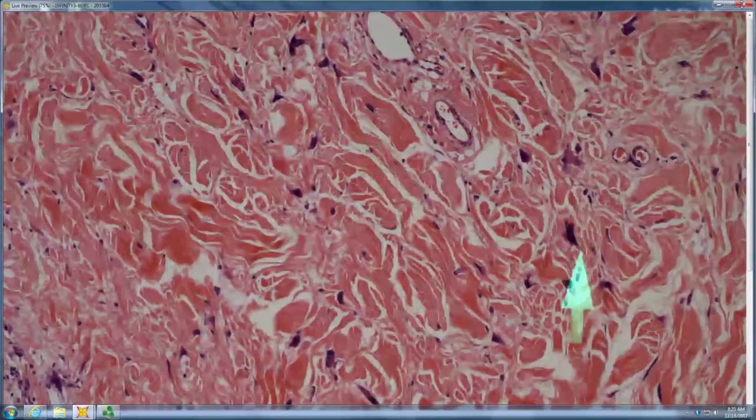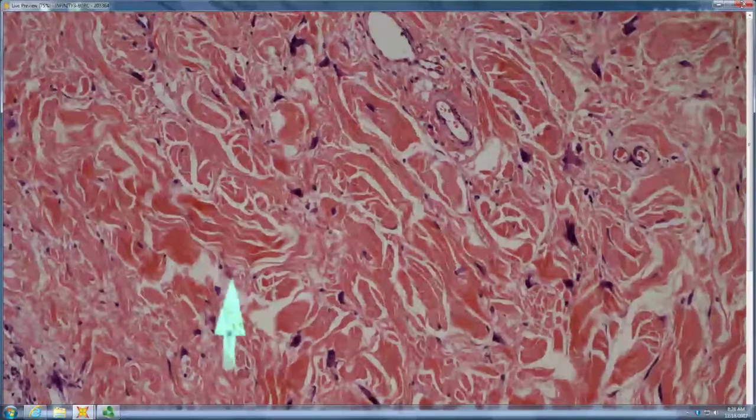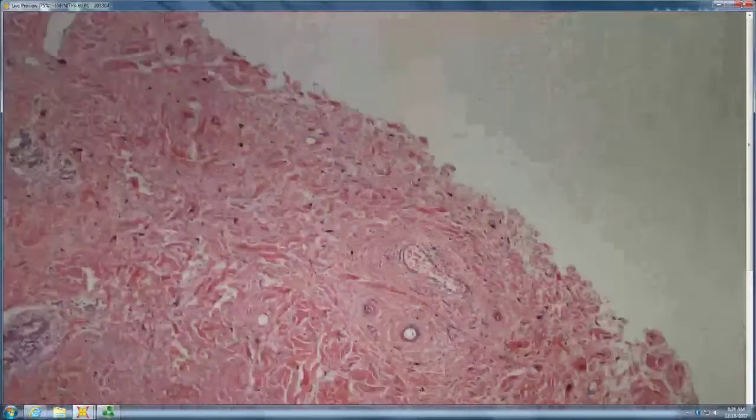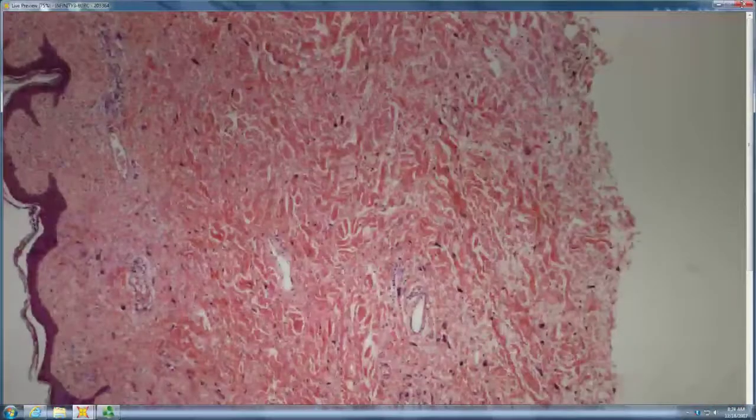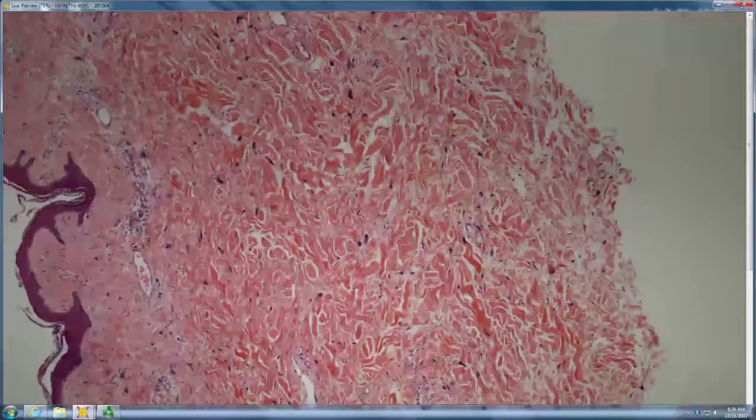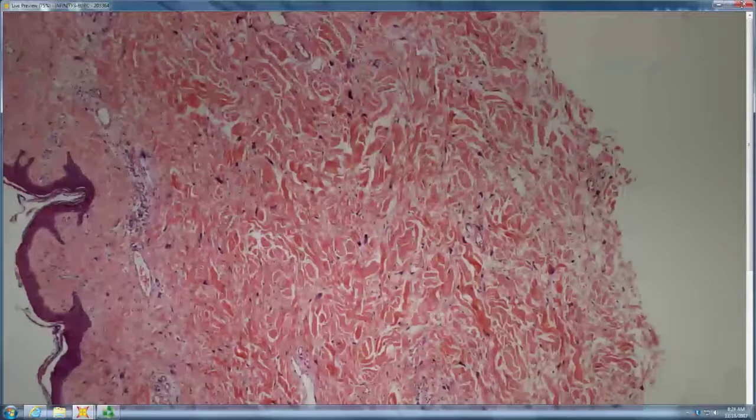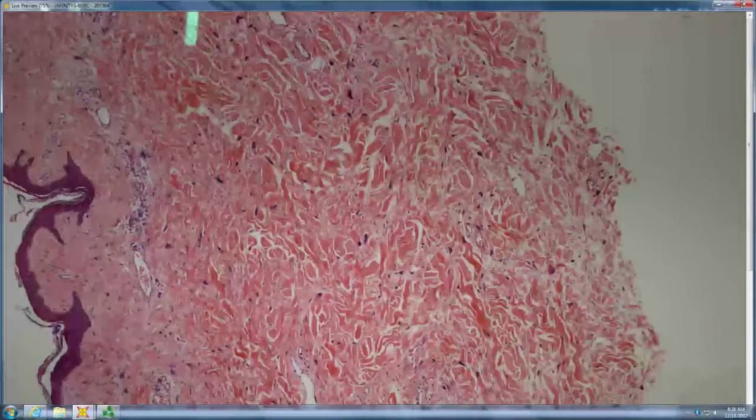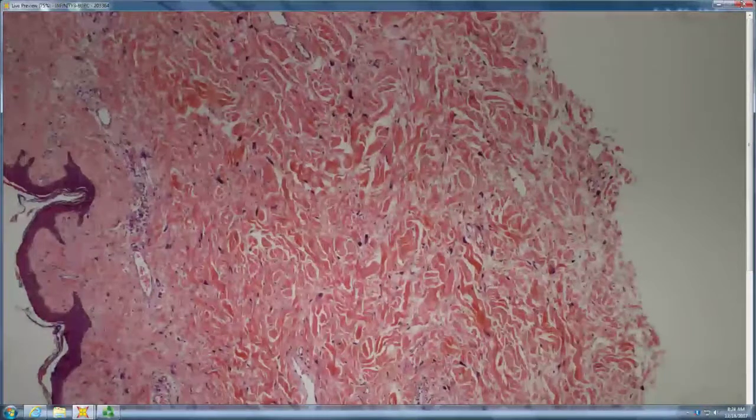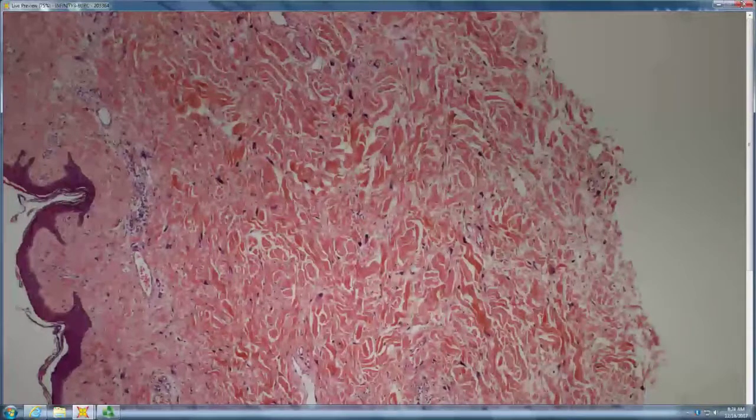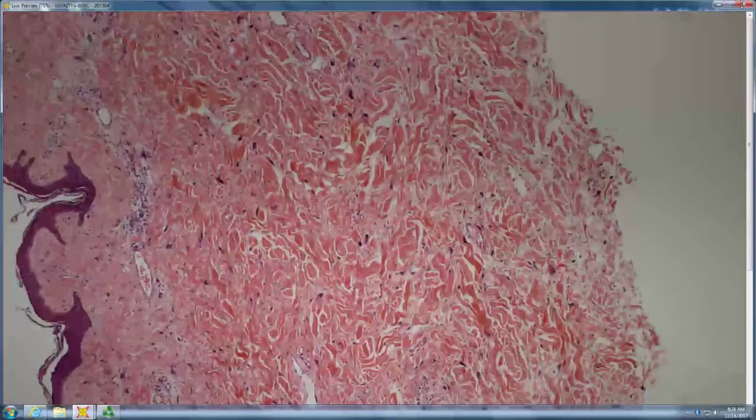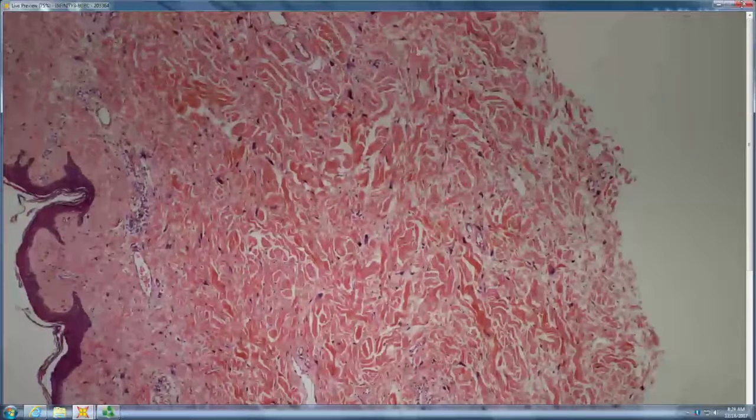So there are many pleomorphic giant cells diffuse in the epidermis. Could be pleomorphic fibroma? Yeah. Absolutely correct. So pleomorphic fibroma. So you commented on the stellate hyperchromatic nuclei, the pleomorphic nuclei. And it is sitting in something that otherwise looks like just a tag with heavy collagen. They're just peppered across it. So pleomorphic fibroma, very well done.